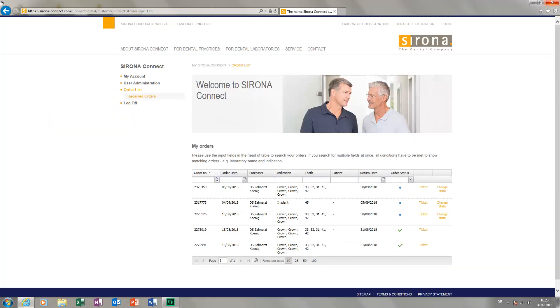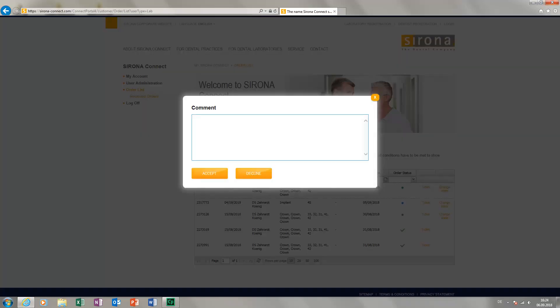Back on the page in the SORONA Connect portal, a blue dot is displayed next to the order, indicating that it has not yet been accepted. To let the ordering dental clinic know that we are accepting the order, we click Change State. This opens a window where you can add comments for the case or answer questions from the dental clinic if needed. Since the clinic has requested to set up an appointment with the patient, we enter our reply here.